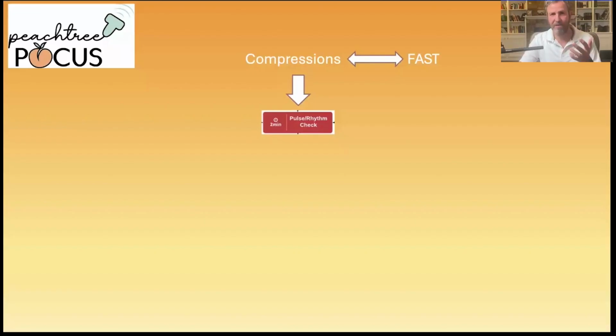Now, I'll admit that this sounds rigid on paper, and in practice, I adapt based on the clinical context. So, for example, if the patient's abdomen is distended, I may do the FAST exam earlier. If the DVT is high on my suspicion list, I might prioritize that. But overall, this systematic approach and doing one thing during compressions or pauses ensures I don't miss reversible causes, and I never let ultrasound extend the pause.